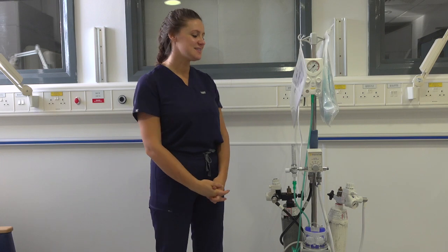Hello everyone. This is our circuit designed to deliver humidified gases to preterm infants in the delivery suite. I am now going to chat you through how to set it up in preparation for a preterm delivery.